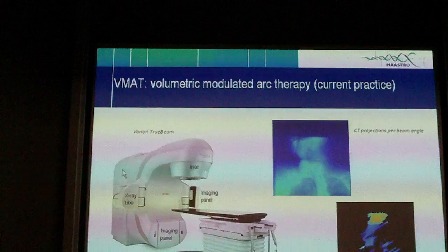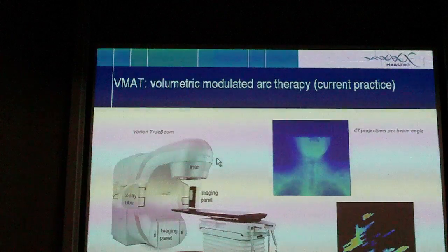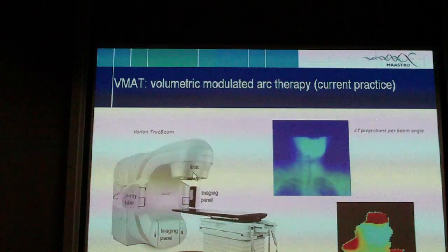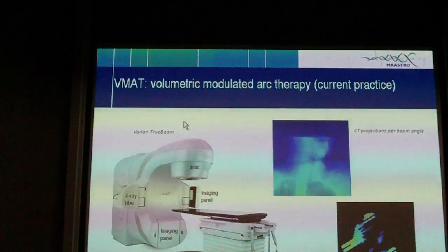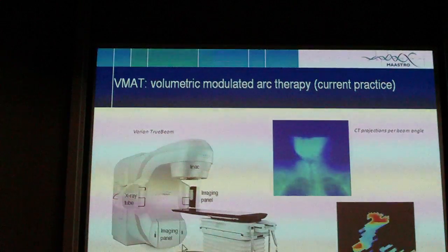So we have the newest linacs, and these are Varian TrueBeams. Over here on the head, this produces the X-rays. This is connected to this X-ray tube, so it travels the whole way towards the head. The patient is positioned over here, so the irradiation comes from top to down, so to speak. There are some imaging panels, like you see over here and here.